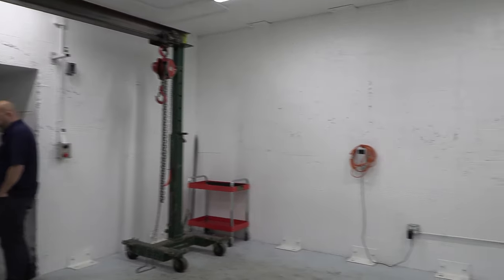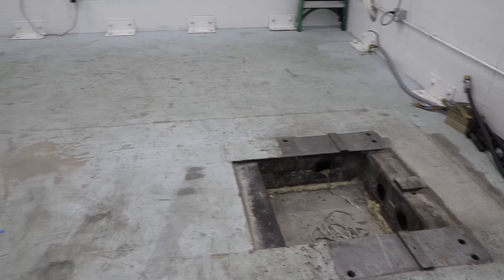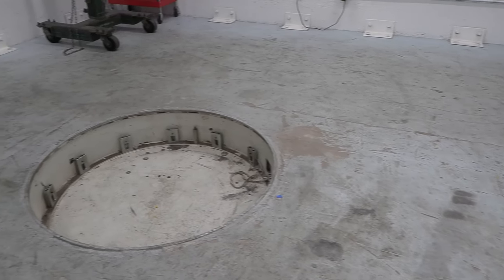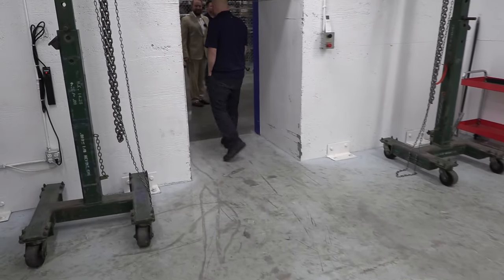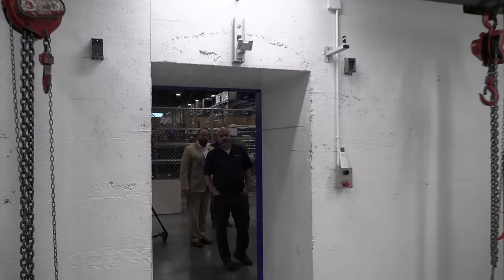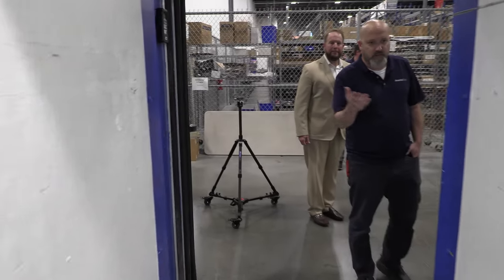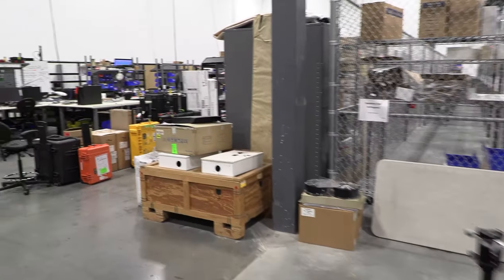Oh my gosh. Take a look at the floor, guys. You see the mounting points for it? It's amazing. That's so expensive to even try this. And the gantry lives in here all the time, right? Yeah, I'll show you the gantry in the stand out here. They're removing this. Some places you have to break the gantry from the stand in half, but here we just keep both together. Makes it a little bit easier to remove and to put back in. Wow.